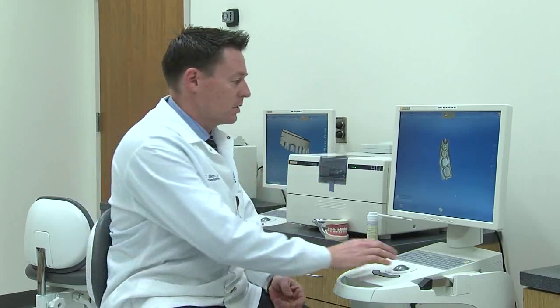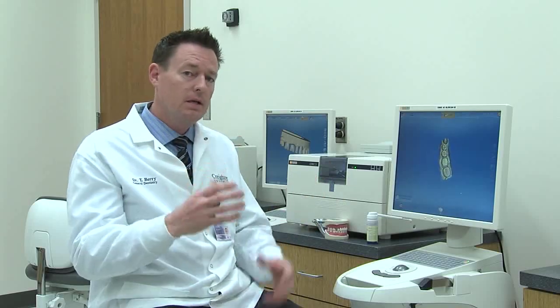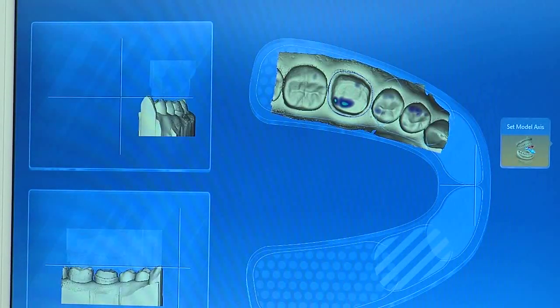And now we move on to the design phase. In this phase we'll take all those images and put them together into a 3D model. The computer is calculating and putting all those images together. It will create the lower arch, the upper arch, and the bite, and we'll take those images and stitch them together in just a moment.